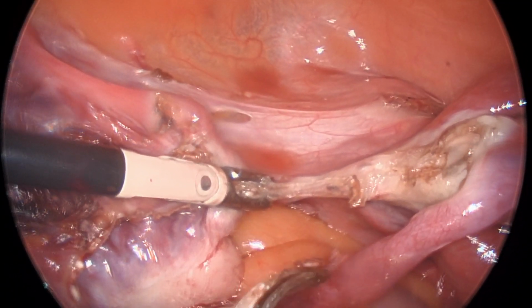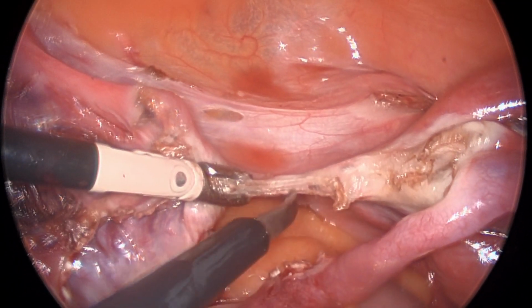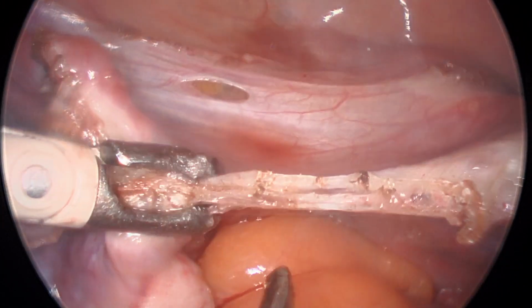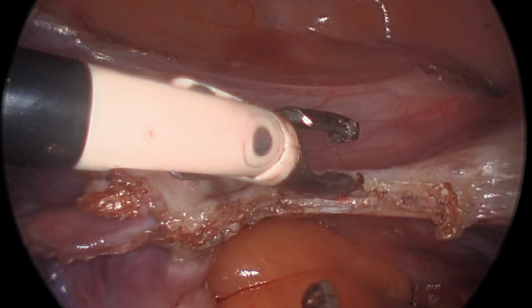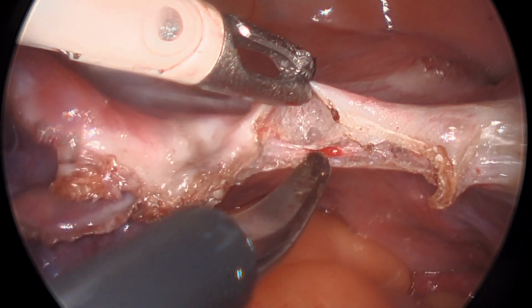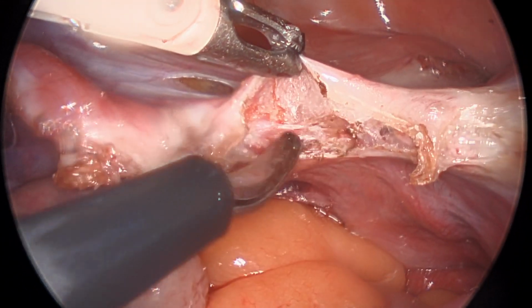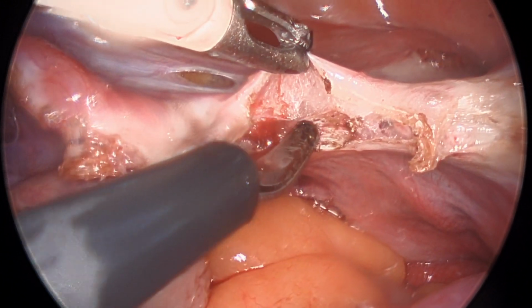In this video, the operator is about to create their bladder flap with Metzenbaum scissors following the division of the left round ligament. However, there is some bleeding from collateral branches within the broad ligament. The scissors are then placed in direct contact with the tissue and activated, providing the necessary thermal spread for hemostasis.